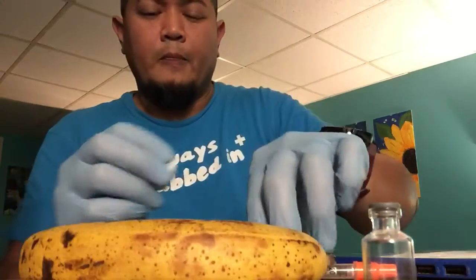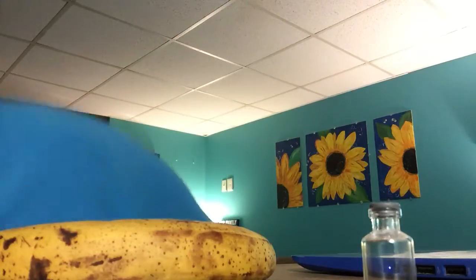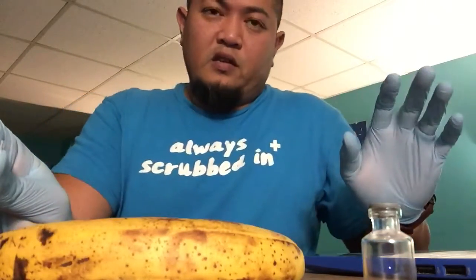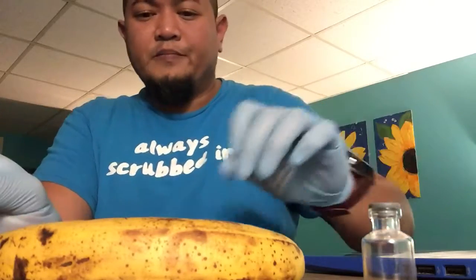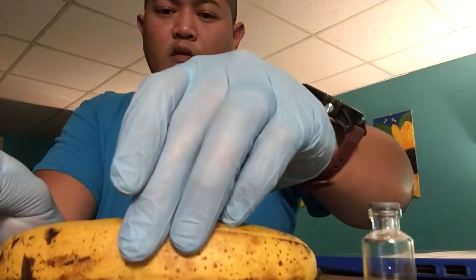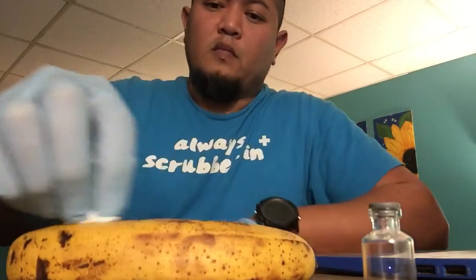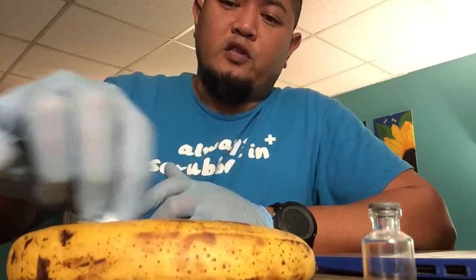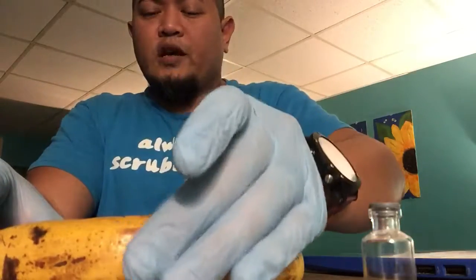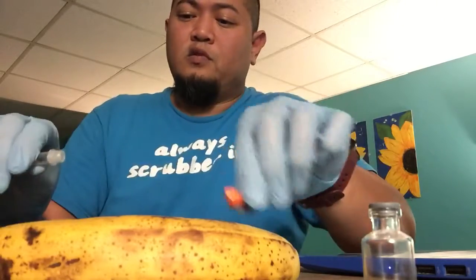here's the banana. Oh, needle down. One thing too, after you're done with the VAD, make sure you dispose of it in the proper sharps receptacle. So you're gonna pinch the patient's skin on the abdomen. How about we clean it up first in a circular motion going outward, and then you let that dry. You pinch it up in the abdomen. Maybe you can do that first.